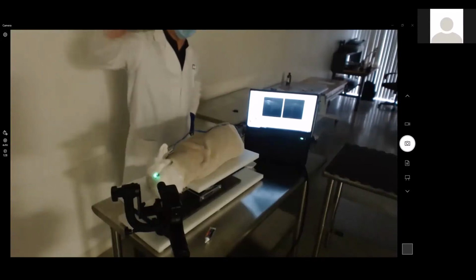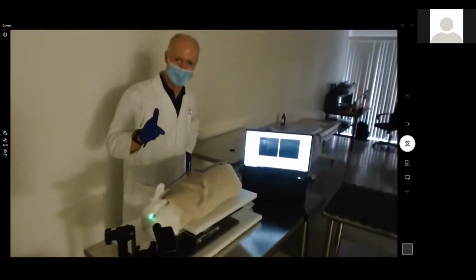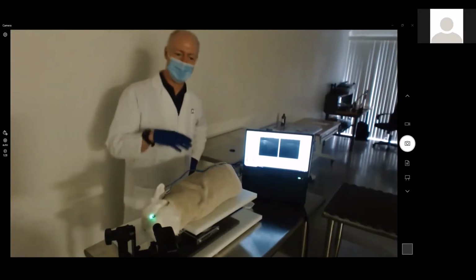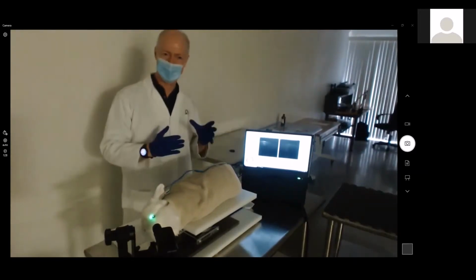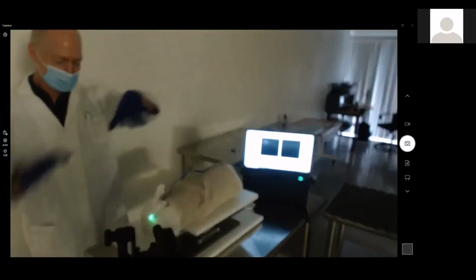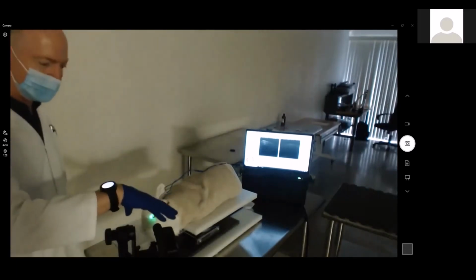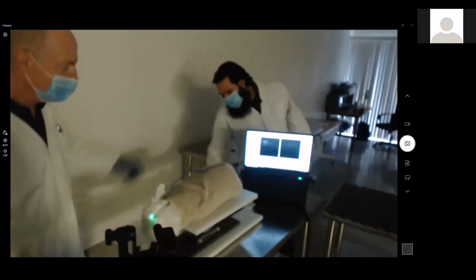Okay, folks, back. We're at wet lab number 3. Sorry about that little delay. We wound up turning off lights and wanted to make sure you could see things on the screen, so that took us a few minutes just to play with the lighting. But I think you should see now the rabbit up front here, and Lily is sitting sedated in front of our optics for our OCT.